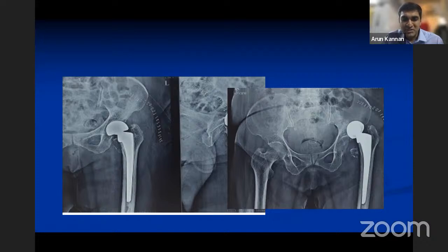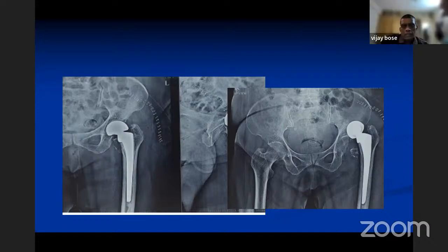Any takes on the reason here? Yeah, this is very typical. When the Hemi sinks, it will sink into retroversion for sure. All your native landmarks will look completely off, and if you follow those landmarks, you'll end up with retroversion. It's a common mistake when you revise a Hemi, and then you will again end up dislocated. So when you revise a Hemi, you need to be extra careful. Yeah, I suspect that is the reason in this case.